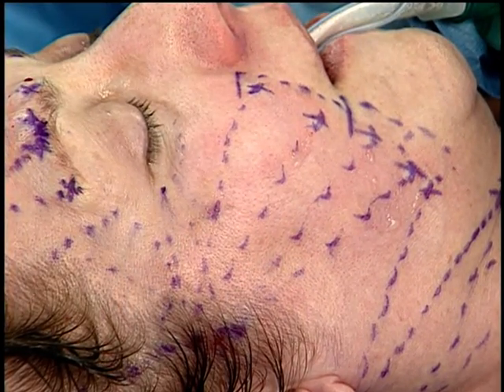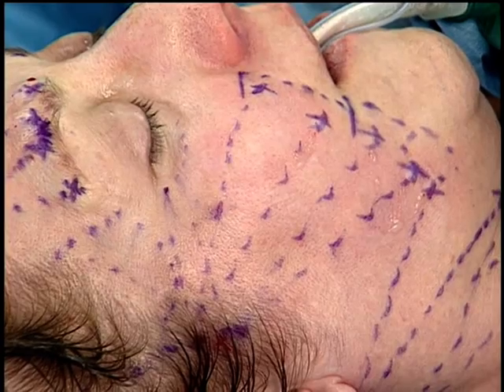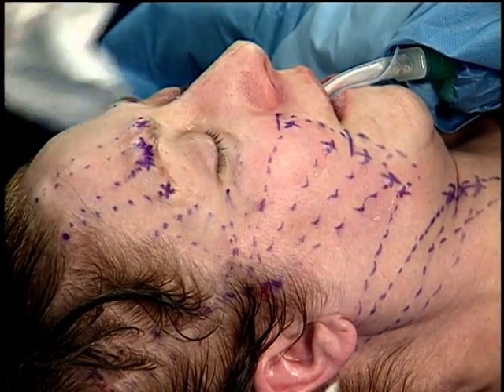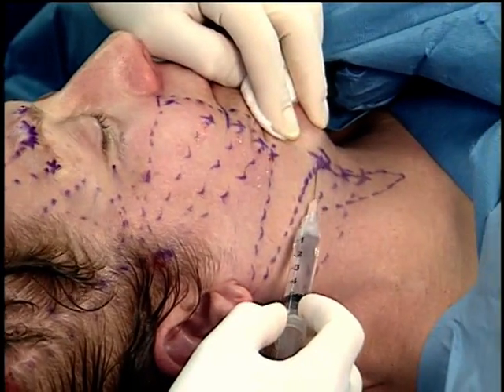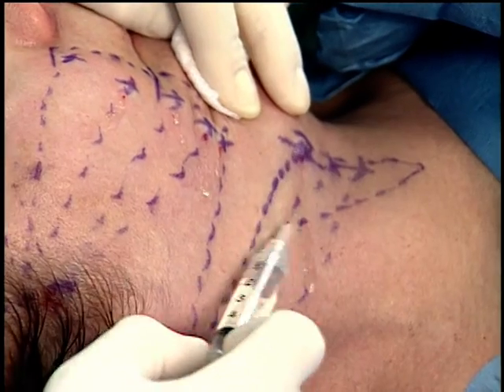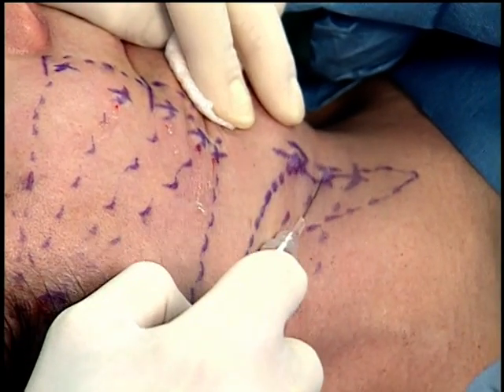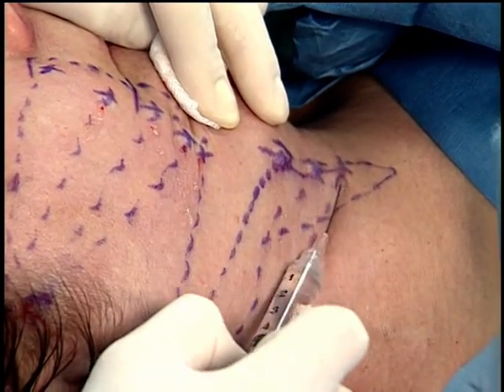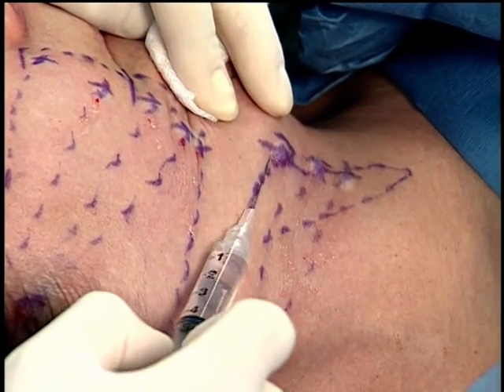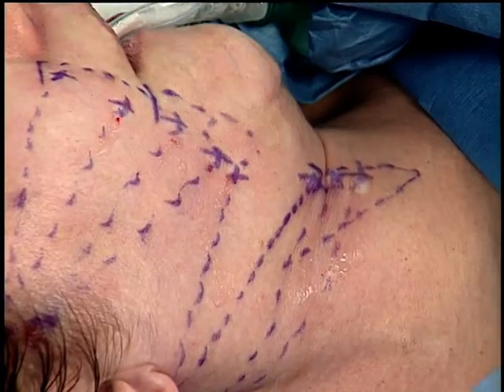Generally, I'll use about 7 or 8 cc's to get all my ports. Get another 30 gauge up, please, so we can just keep switching them. All our exit and entrance ports, same with another 20, another 22 spinal. So we're doing all our entrance and exit points with nice intradermal anesthesia, a nice wheal of anesthesia, and that is the exact point we should pass through when exiting or entering.